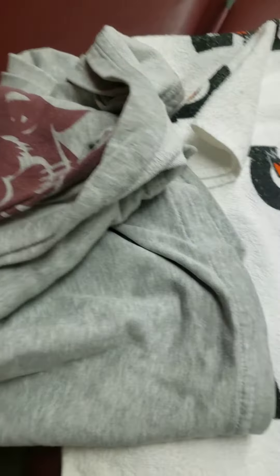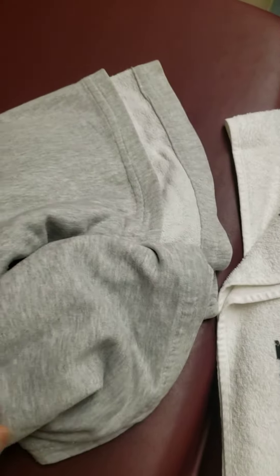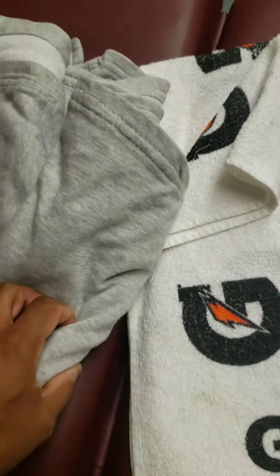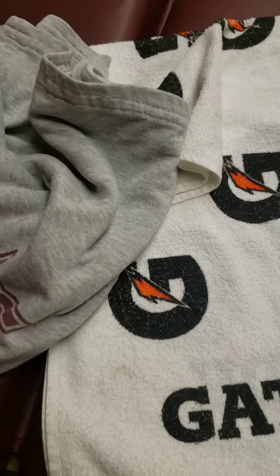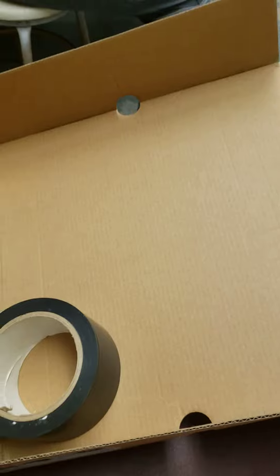All the stuff you see right here are materials or household items you can use to create an improvised splint. You're limited to what your imagination can make up. It ranges anywhere from a blanket to towels, magazines, newspapers, a cardboard box, and duct tape. In a minute I'll show you some of the splints you can make with these items.